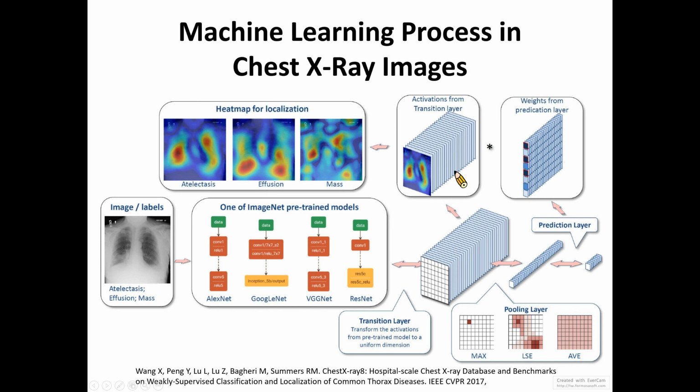Because the pre-trained network already identifies features related to its pre-trained images, ideally you should be able to see something important in the new images, and so you can reduce the training time. You don't have to train from the beginning. You can train based on the established training result. So this is the idea of transfer learning.